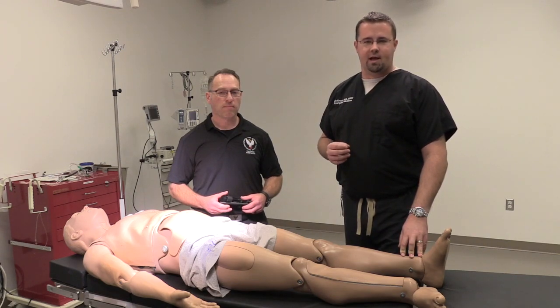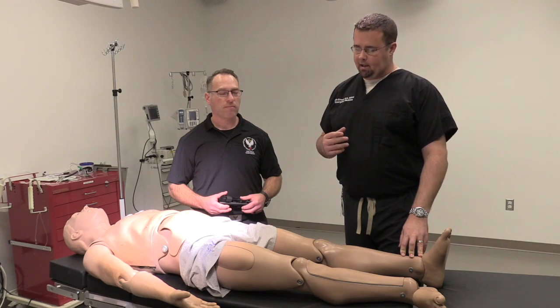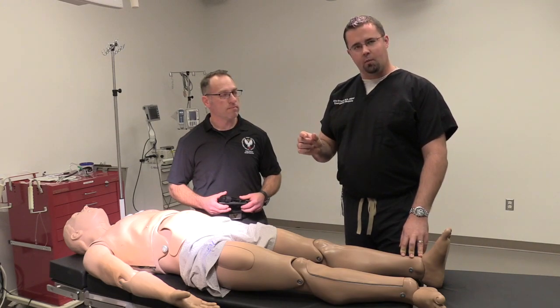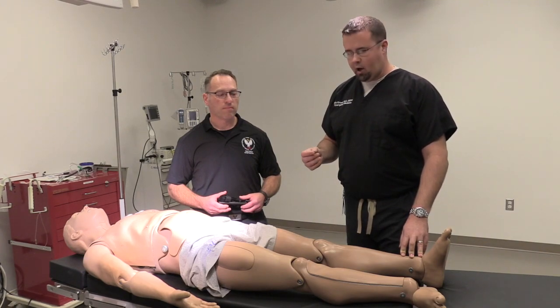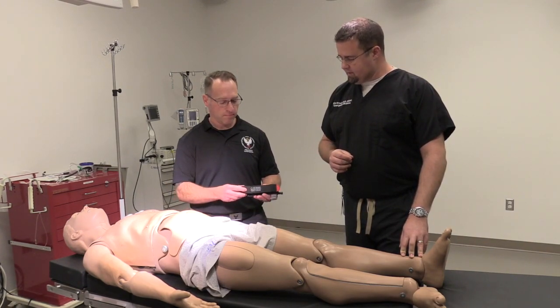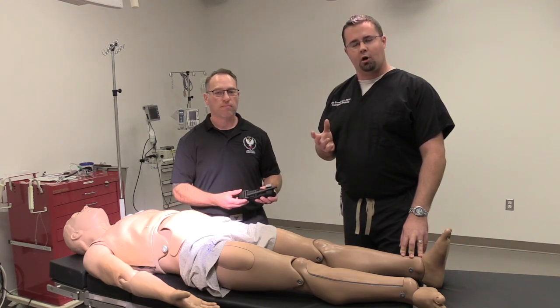What we have to remember is that these are safe to put on. There was a time, thinking way back, that if you're tourniqueting with something that was a narrower band or something that would cut into the skin, you could do some damage. These being a broad band application device, they really are a safe thing to use.